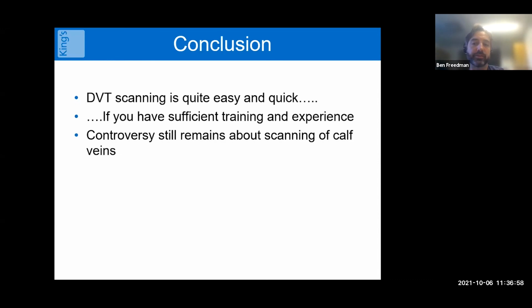It's an interesting thing, and there are certainly places that are practicing both ways. One of the things which I'm aware of is that I'm not sure that the NICE guidance about the rescans is always followed properly in those centres which are only scanning down to the knee. I've visited students in places who are repeat scanning everybody, irrespective of what the first scan showed and what the D-dimer and Wells score were, and some centres that are not bringing patients back for the repeat scan. So that's another thing. It sort of adds to a bit of confusion.